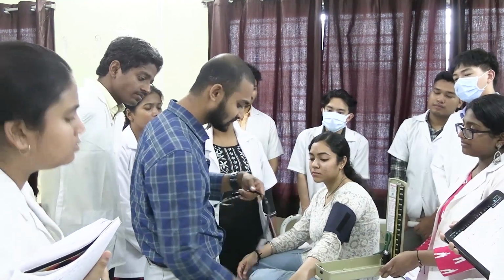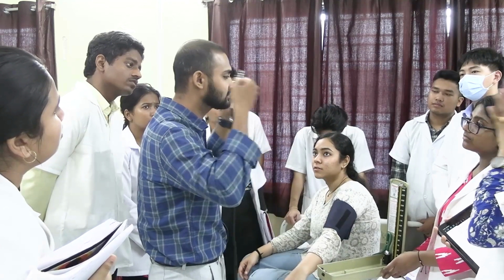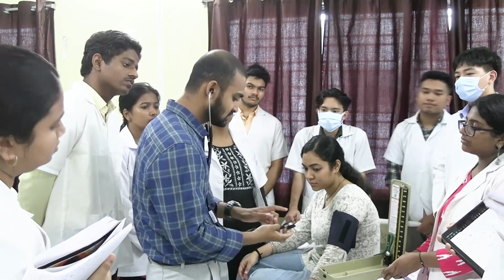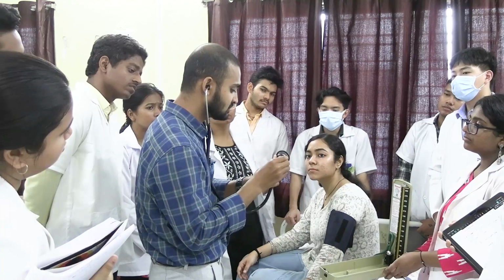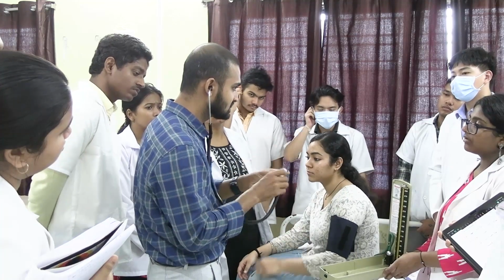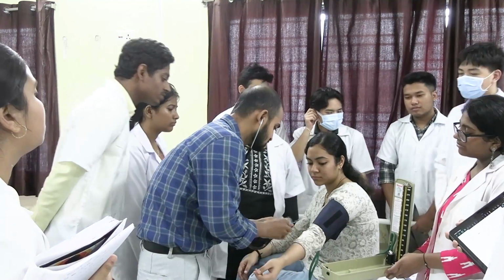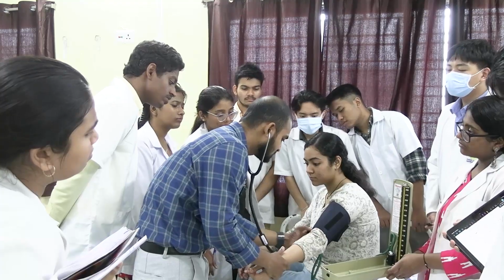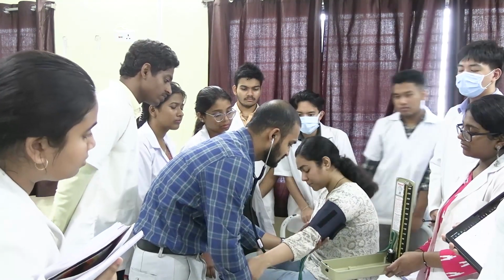Fine. So now what is the direction of the ear knobs? Forward and middle, right? And you should see whether it is on or off. Now it is off. One clicking sound will be heard. Now it is on. Fine. So now we know her palpatory BP. This is around 97, or 96. Fine. So now we will measure her auscultatory.